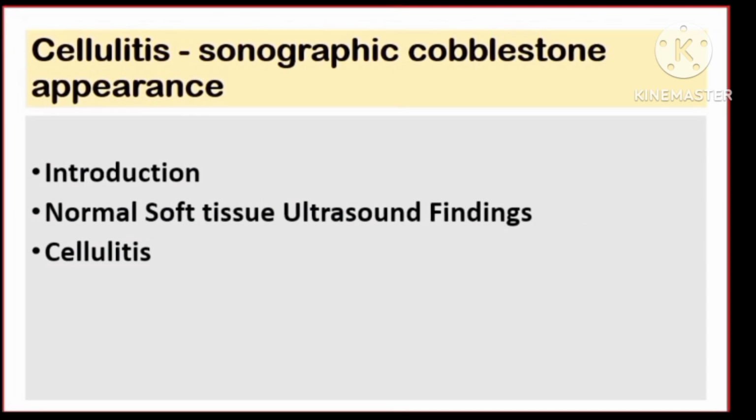We will begin with introduction, then we will talk about normal soft tissue ultrasound findings, then cellulitis.